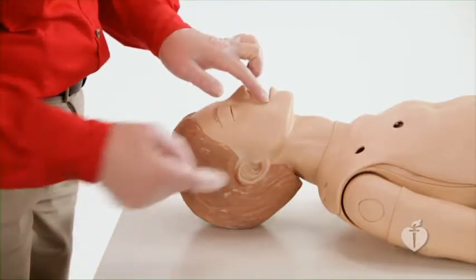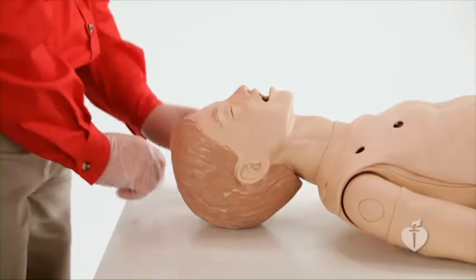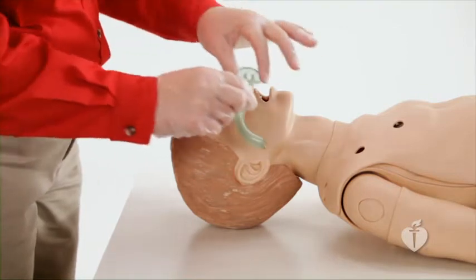If the infant or child is unconscious and has no gag reflex, an oropharyngeal airway may help maintain a patent airway. To select the correct airway size, place the airway next to the face. An appropriately sized oral airway should extend from the corner of the mouth to the angle of the child's jaw when the airway is positioned next to the face.